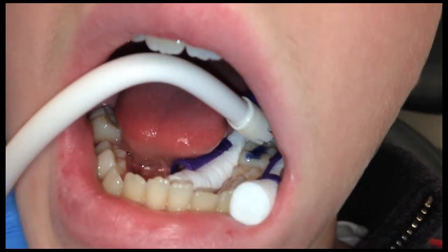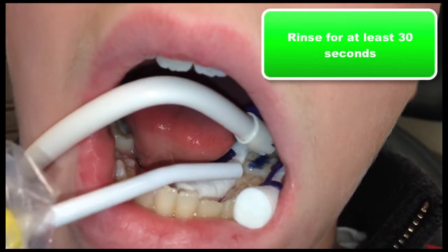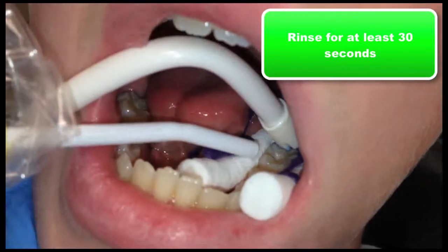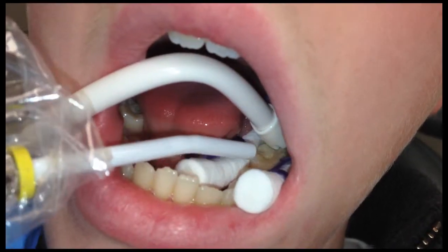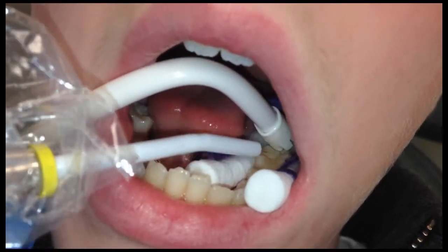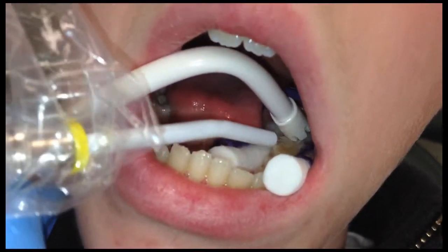Next, you will rinse the etchant off of the tooth. Rinse for at least 30 seconds. It is important to keep the saliva ejector close to the area you are rinsing to ensure that the etchant material is evacuated directly into the suction tip. You can also use a high-speed evacuation tip if preferred.